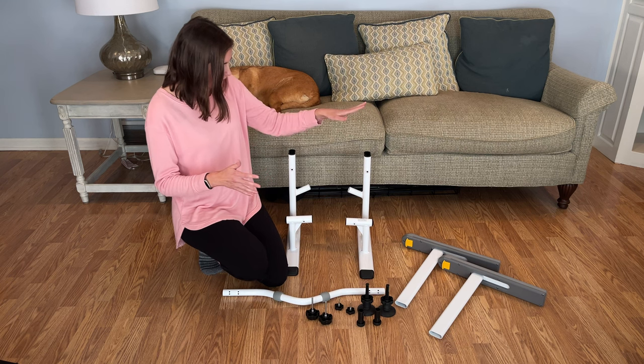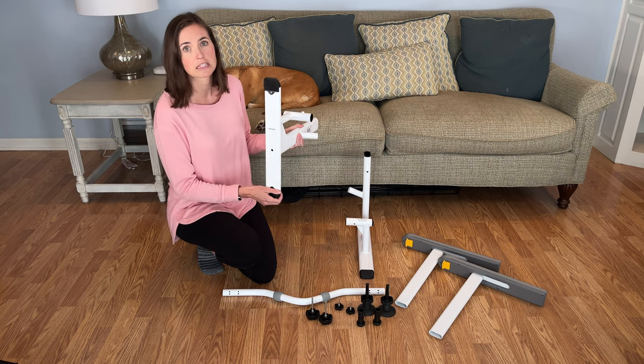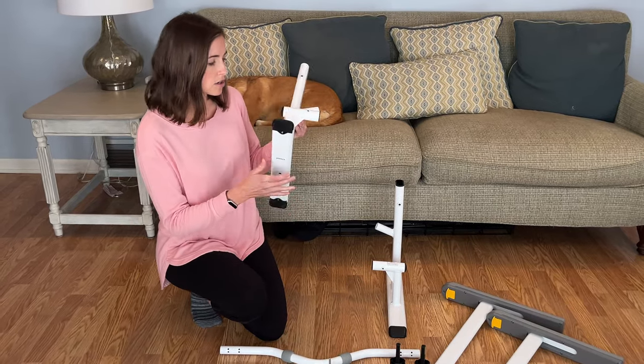First things first, we're going to locate the legs. These legs are going to look like this. You want to make sure that they have these rubber feet in place. These are really important to make sure that it slides into position and holds very securely. So if you get it used, make sure you double check that these are in place.